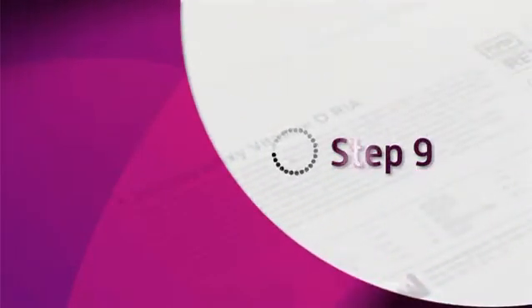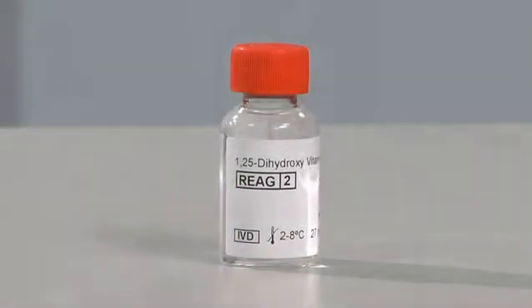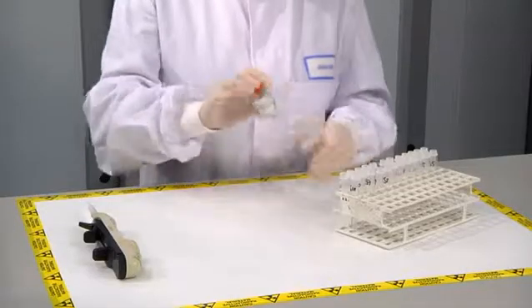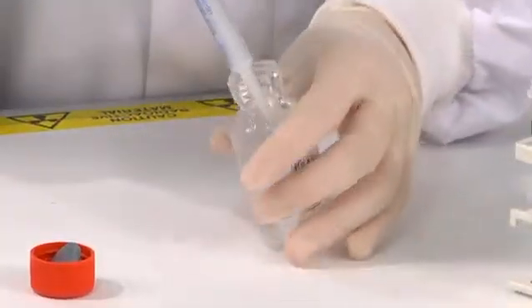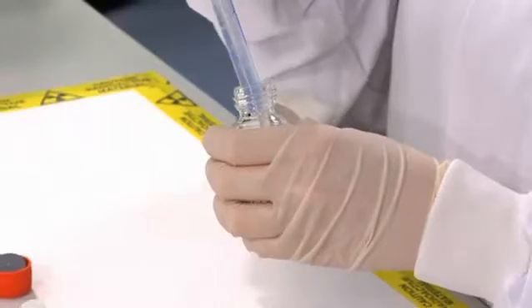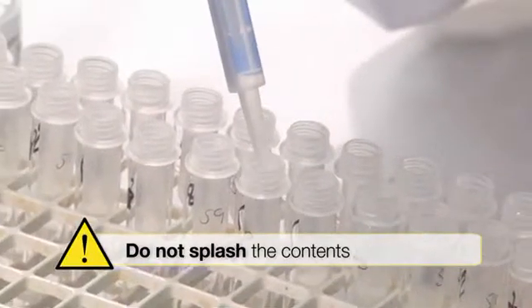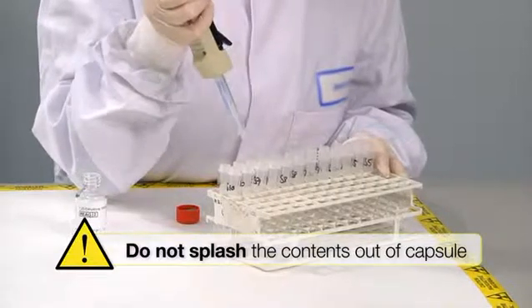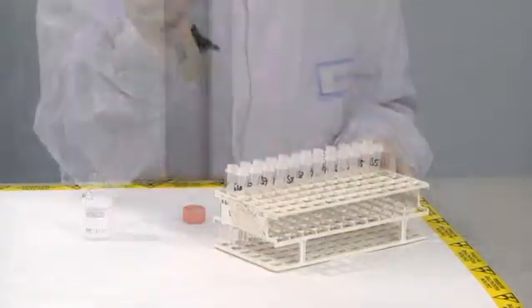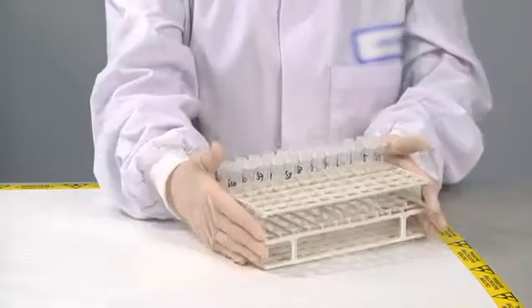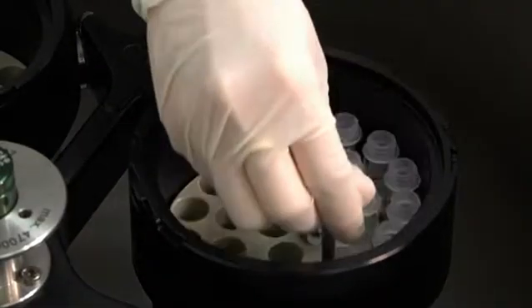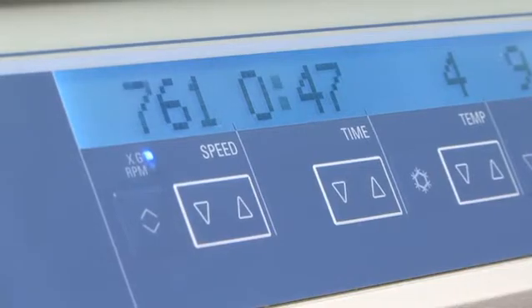Step 9: Add 150 microliters of elution reagent to all immunocapsules using the same technique as for the wash. Allow reagent to soak into solid phase for 1 to 2 minutes. Centrifuge at low speed between 500 and 1000G for approximately 1 minute to collect the eluate.